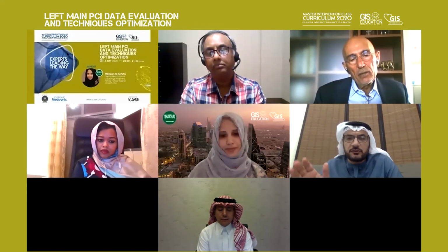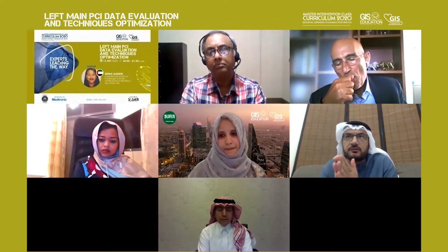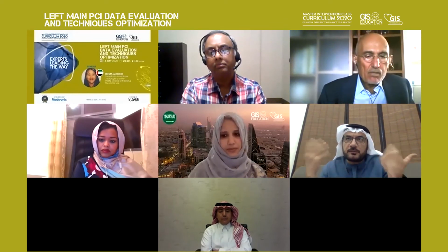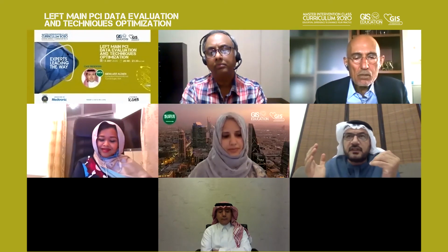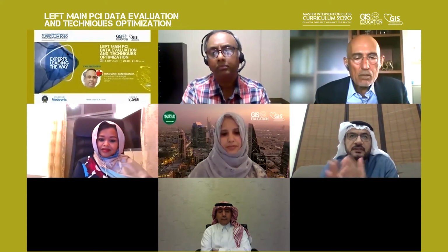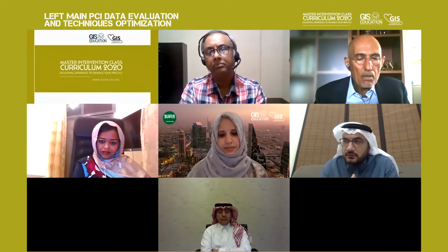The EXCEL study, which was 2011 to 2014, used imaging in up to 70%. Sometimes when we ask a proctor to come to our country, they are experts, and they don't use imaging. The problem here is that Dr. Mervet says imaging has a role, but in real life the uptake of imaging is less than 10%, while in randomized clinical trials like EXCEL we see it up to 70%. So it is mandatory to use imaging if we want to improve our skills.